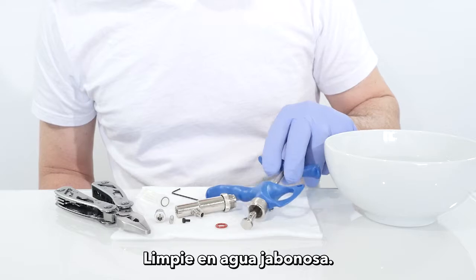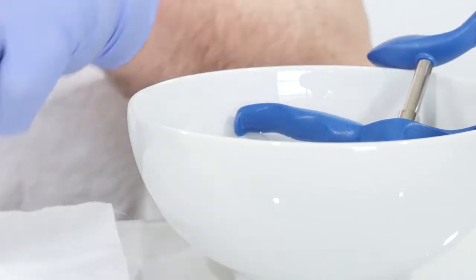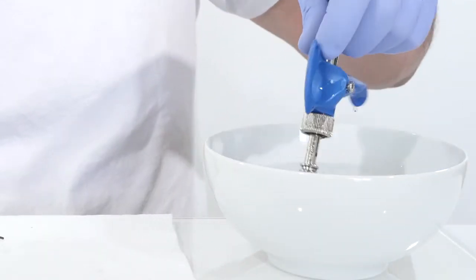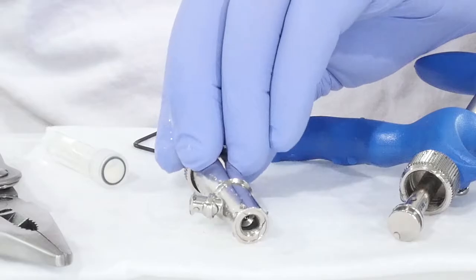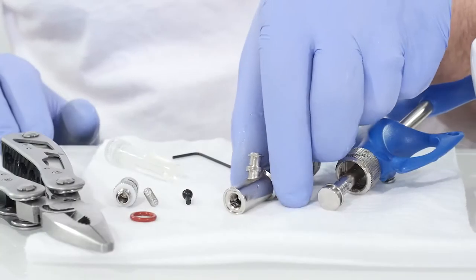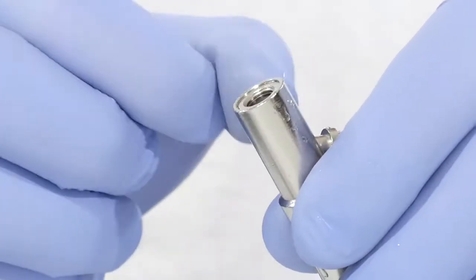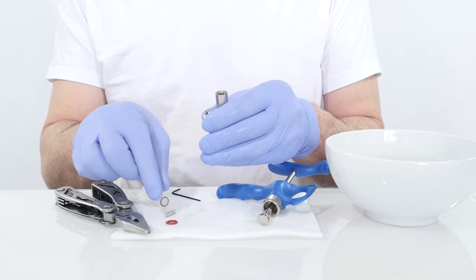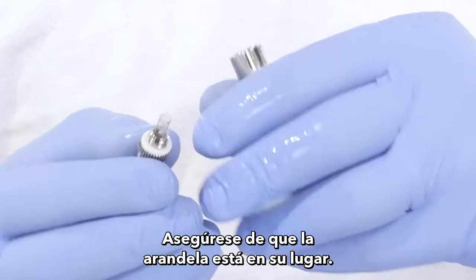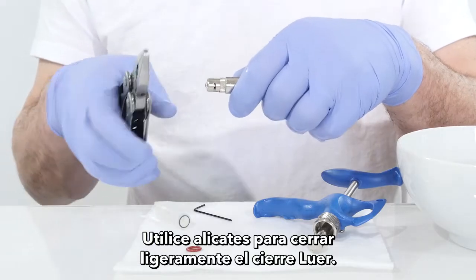Take the spring and valve out. It is recommended to also take out the o-ring. Clean all parts in soapy water. Assemble the parts back: place the valve and spring, make sure the washer is in place, then use pliers to slightly close the lure lock.